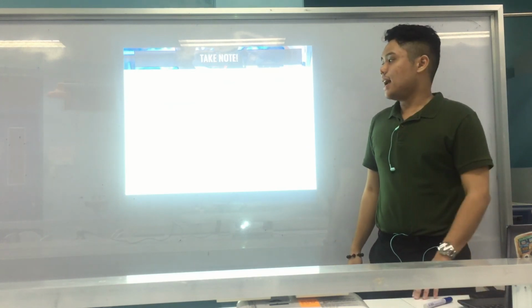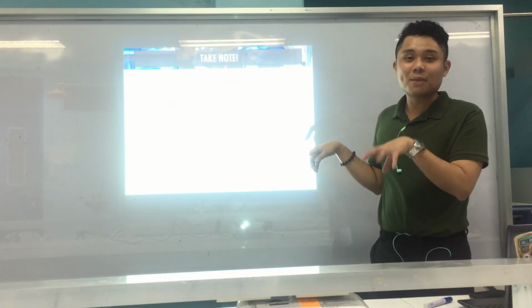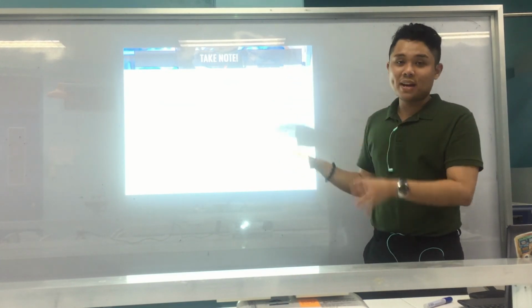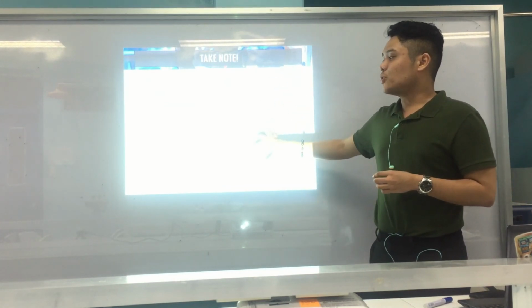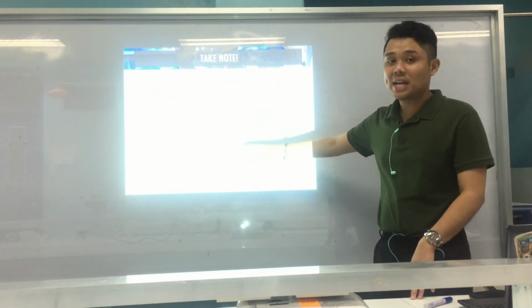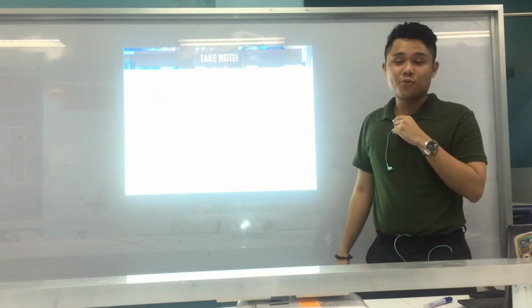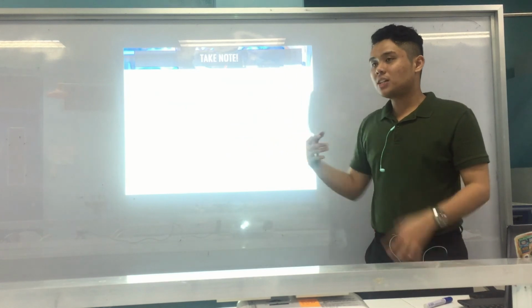Okay? And last note, I actually included this from the Bailey and Scott's table. I mentioned chapter 5 in your Bailey and Scott's. It summarizes all specimens and their specifications, how to process them, what culture media are needed. So I appealed to it. Alright, the note here is do not perform routine stool cultures for patients whose length of stay in the hospital exceeds 3 days, and whose admitting diagnosis was not diarrhea, because later we'll learn that they are suspected of being infected with Clostridium difficile. Because remember, they were not admitted for diarrhea.